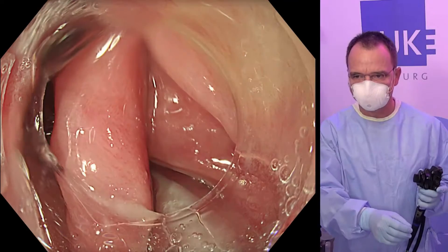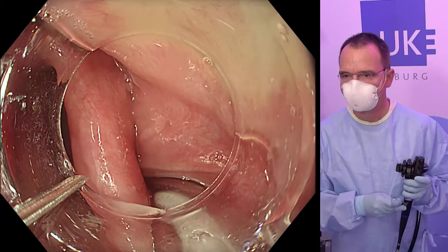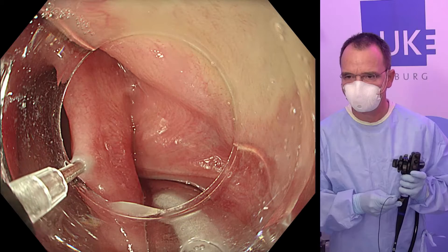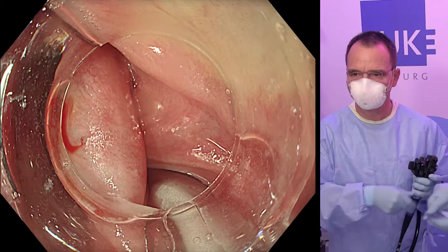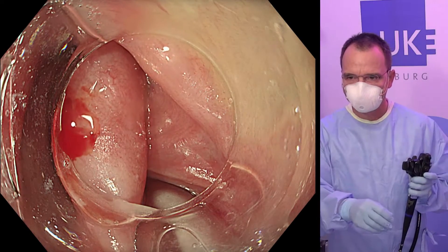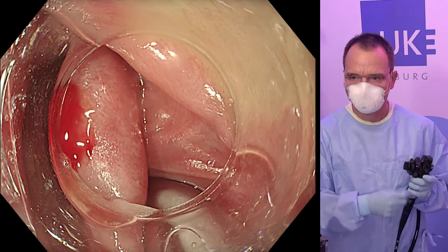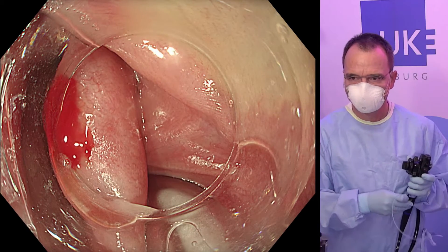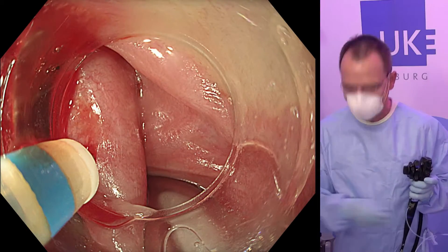Treatment starts with minor injection into the septum with this special needle. Just a minimal amount of bluish saline, which should be enough. We then continue with the knife, which is the dual knife by Olympus, which also allows for simultaneous injection.